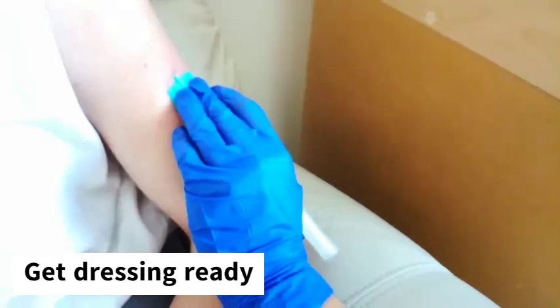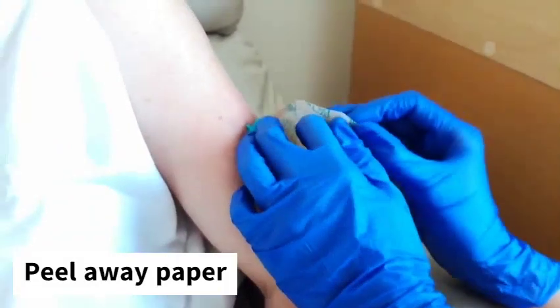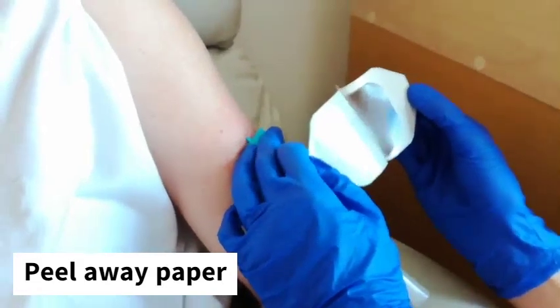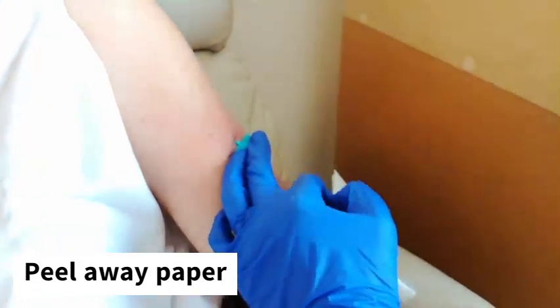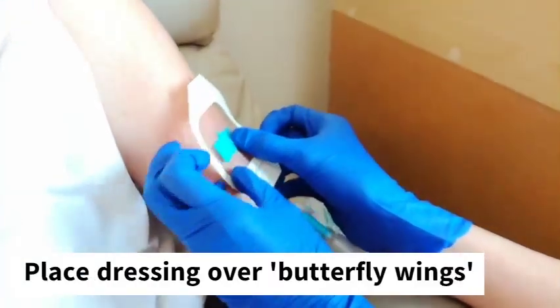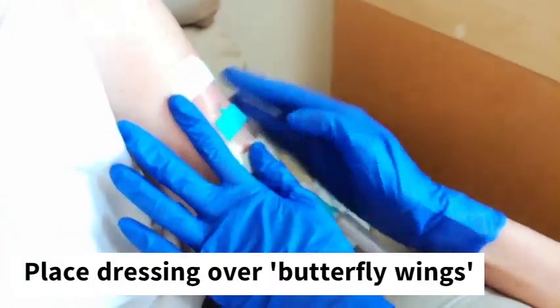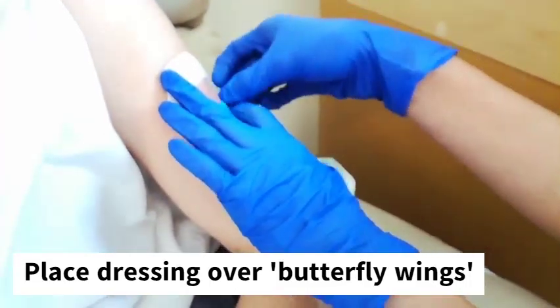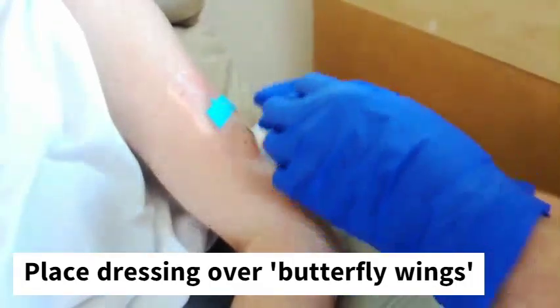While we get our dressing, we peel away and pop it over. Now we can be hands-free and deal with the rest of the procedure. We just remove these bits here to help it stick down.